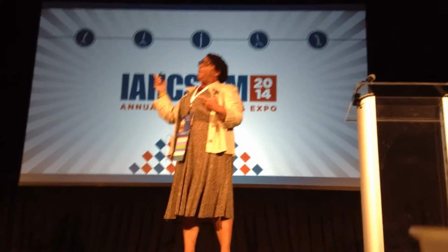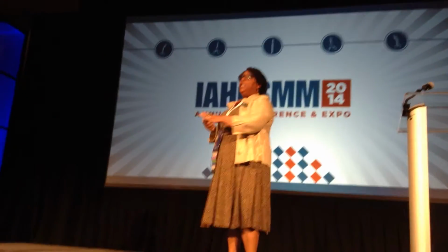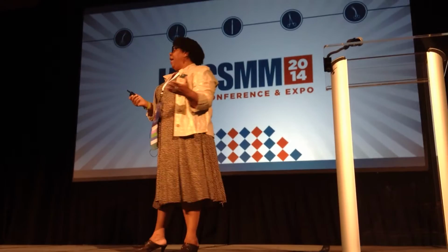So I can understand that if I had a robot, she would help me, but only when she was on her game. Now, understand, Penelope requires a human being to put the instruments on the rack. And the human being is supposed to check the instrument to a certain point before they put it on the rack. So Penelope is not a freestanding robot. She doesn't go and get her own stuff. She only does what she's programmed to do.